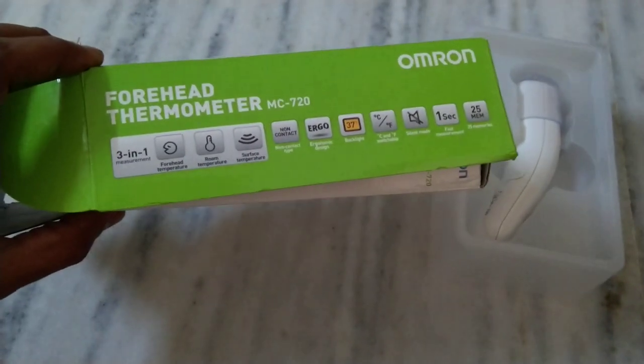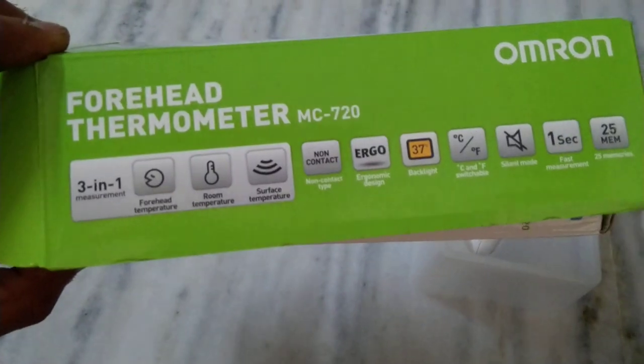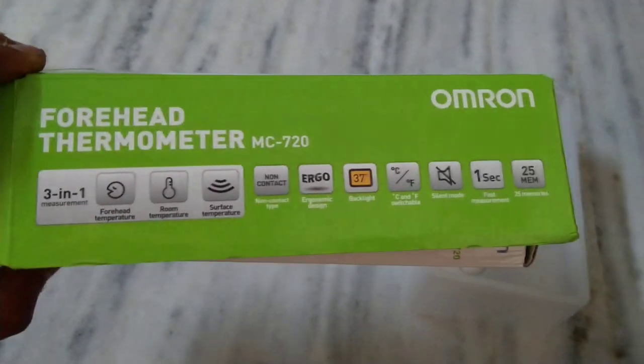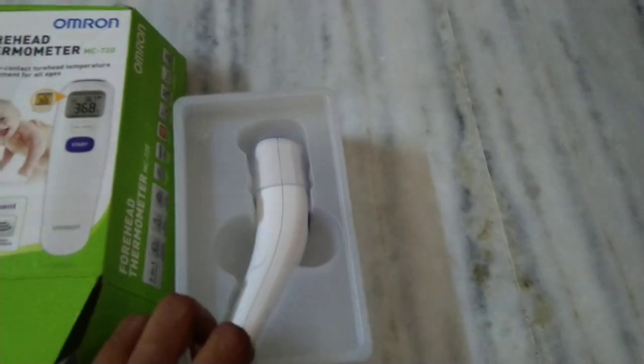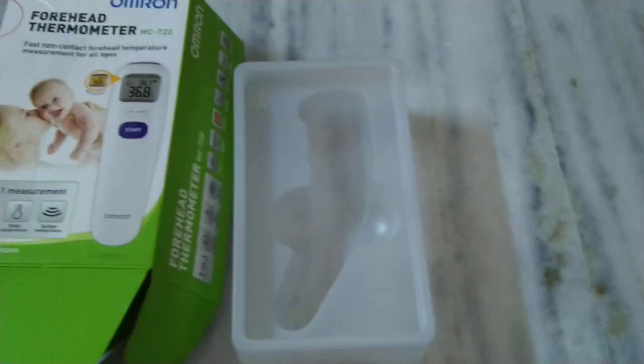This Omron contactless thermometer has many features — it can check forehead temperature, room temperature, as well as surface temperature. In the box you only get the manual and the device itself. It's very sleek and easy to handle.